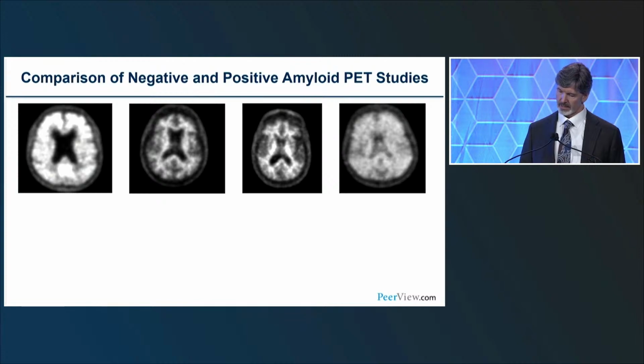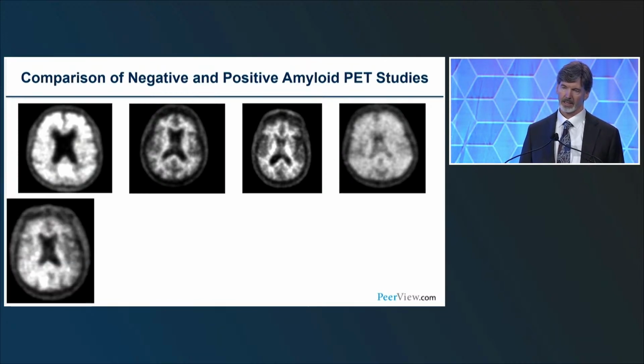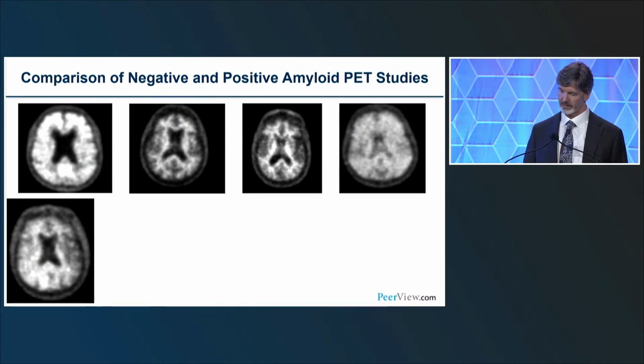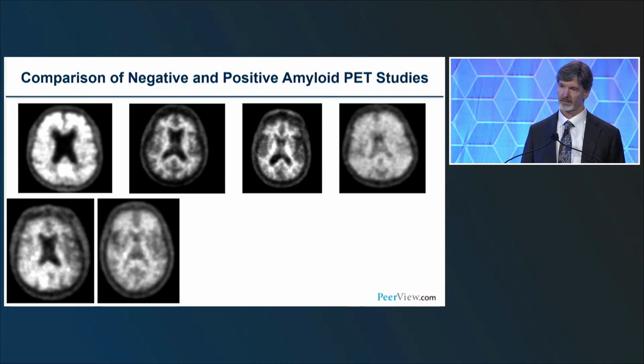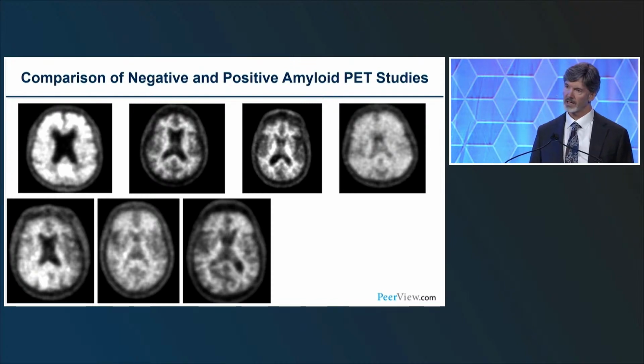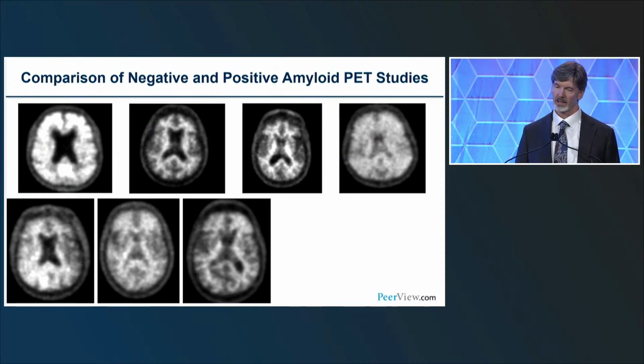So that's something to keep in mind in terms of intensity of the uptake that you're seeing in that PET scan. Okay, how about this case? You're right, positive amyloid scan, but not entirely homogeneous, only regionally. How about this case? You don't see the great separation between white matter and gray matter, right? Positive. What's this? Regional positivity, where you don't see it everywhere. But this is also called positive by most of the interpretation guidelines you'll see, and it's also indicating amyloid.